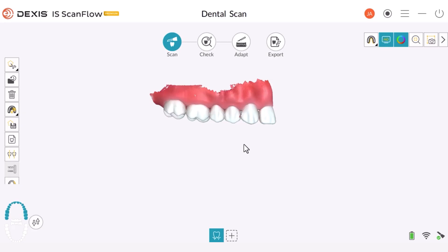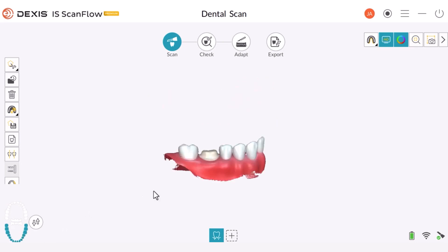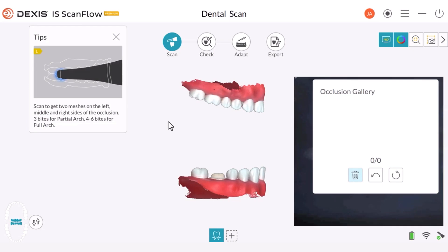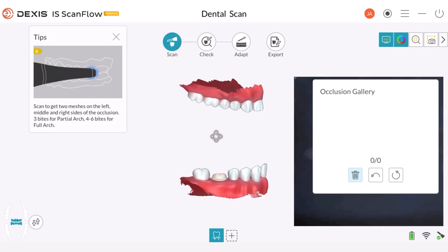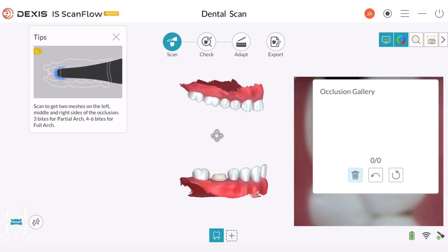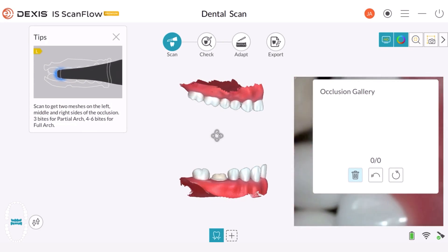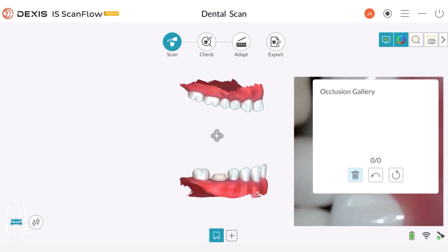In this recorded class, we will explore the process of capturing a buccal impression. In this case, we have scanned both the upper and lower quadrants. Before proceeding with the scan, make sure you have scanned the buccal surfaces thoroughly. When you scan the buccal bite, align the scanner with the occlusal plane.